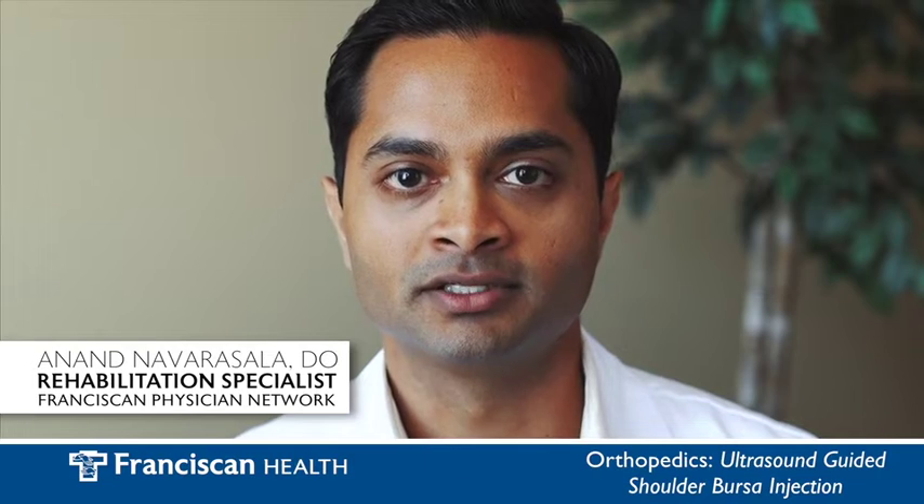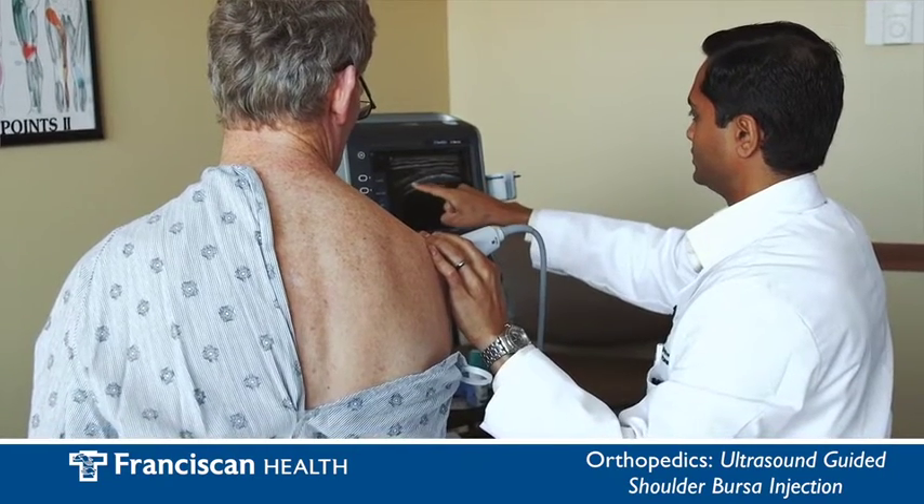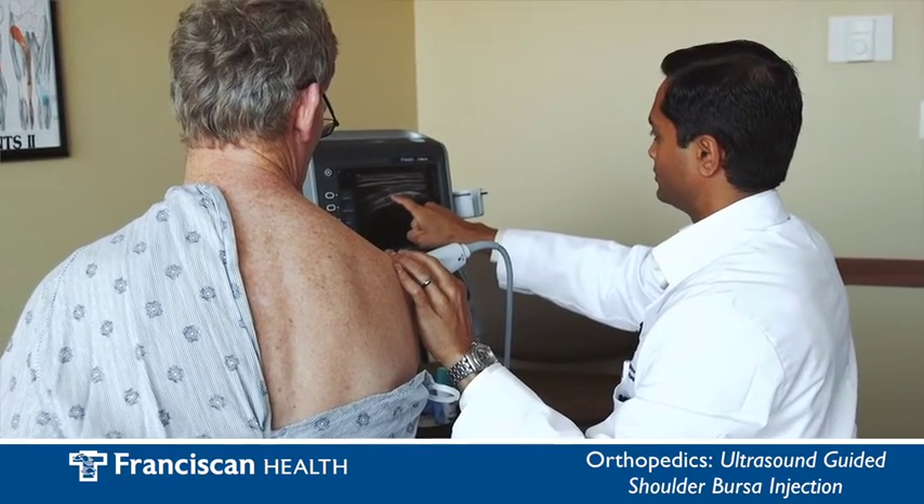Hi, I'm Dr. Navarra Sala and I'm a rehabilitation specialist for Franciscan Physician Network. Today I will be demonstrating an ultrasound guided shoulder bursa injection.